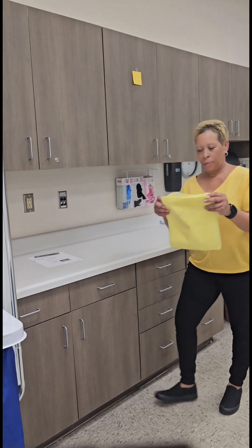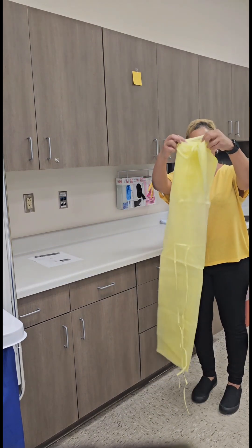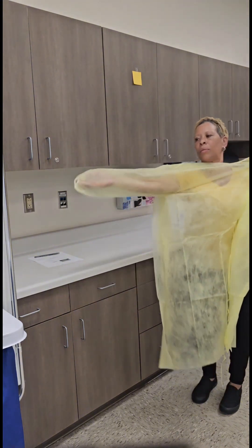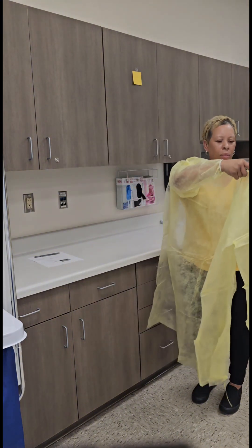Manually unfold the isolation gown. Do not shake it open. Ensure that the back of the gown is facing you, then place your arms into the sleeves.